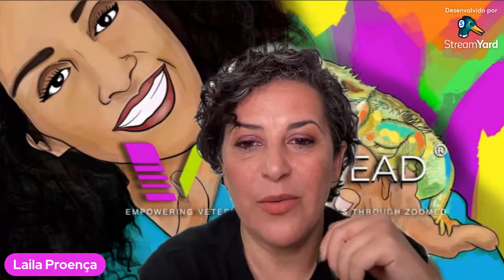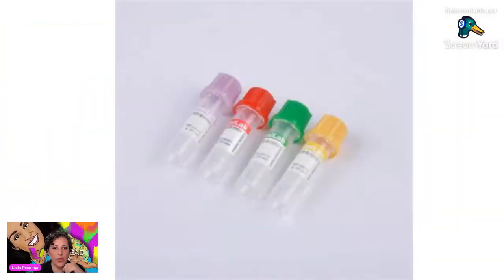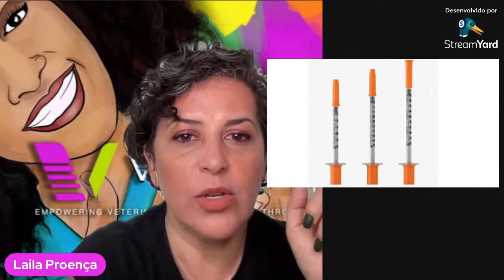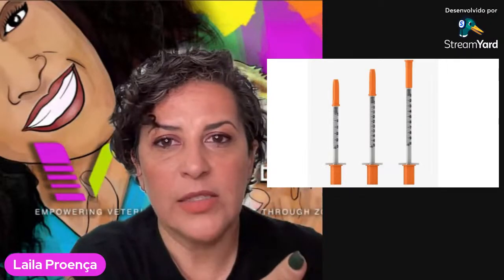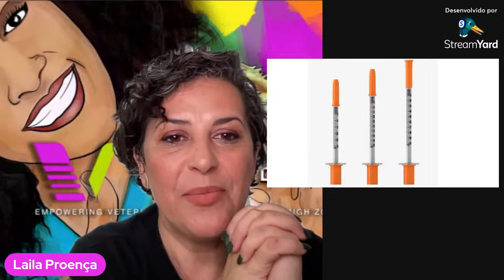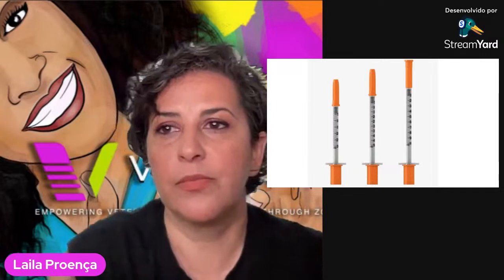The second thing that we were talking about are the tubes, which you guys are very aware of already. And the other thing, guys, that I also want to talk to you about are the syringes. Okay, so it's usually very helpful to have syringes that are smaller. I'm talking about the US, maybe you have different syringes in your country. Certainly we have different syringes in Brazil. But some syringes, the total volume of the syringe.